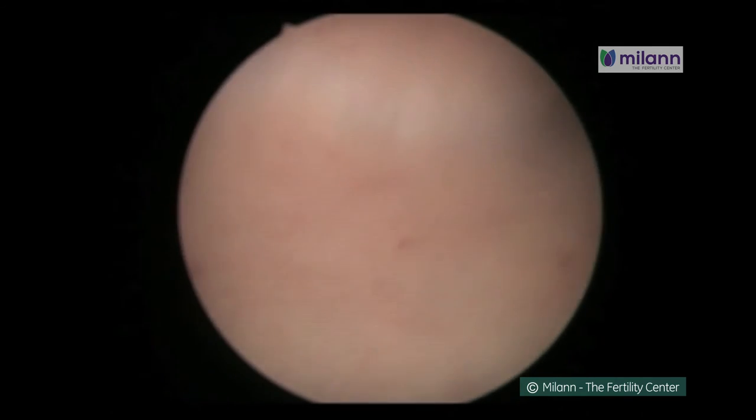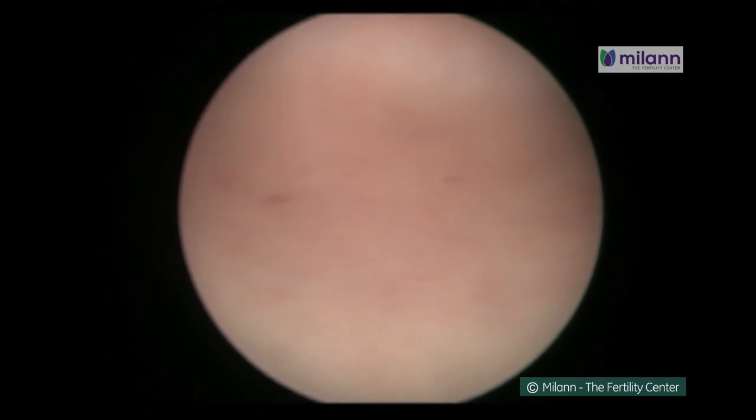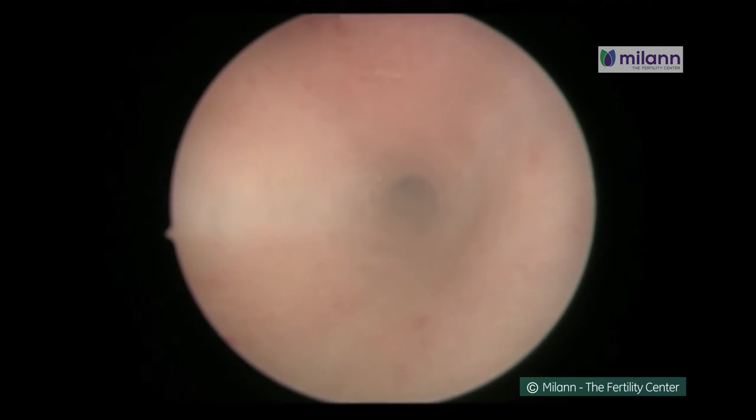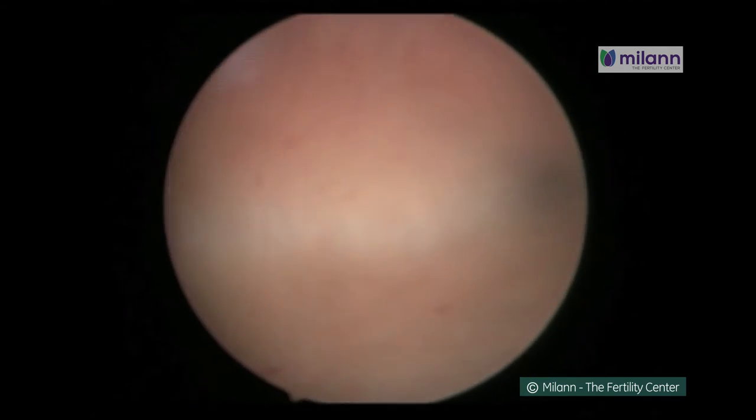The light allows your doctor to see the openings of the fallopian tubes into the uterine cavity. Finally, if surgery needs to be performed, small instruments are inserted into the uterus through the hysteroscope.